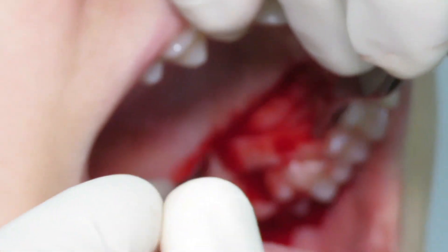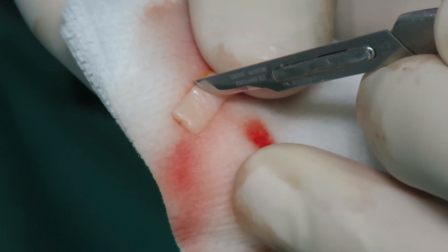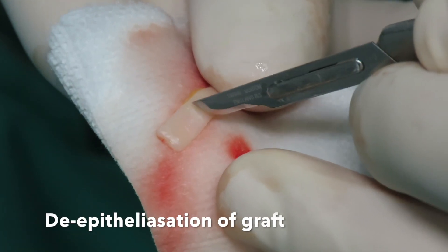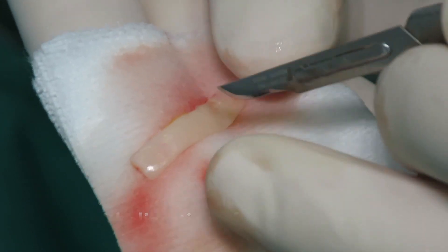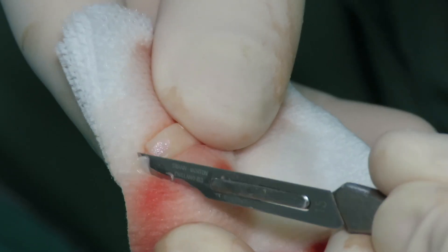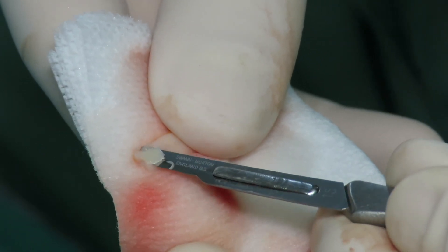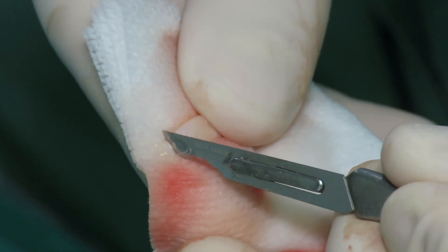The graft is dissected properly. We then mark lines across the width of the graft to properly visualize where we de-epithelialize, and then we de-epithelialize — meaning removal of the epithelium layer — with a precise and sharp dissection.